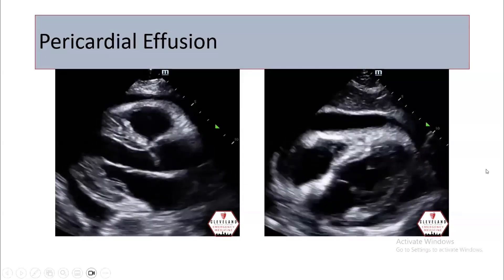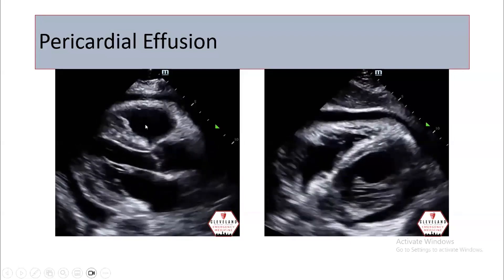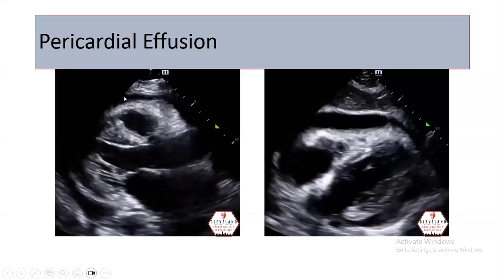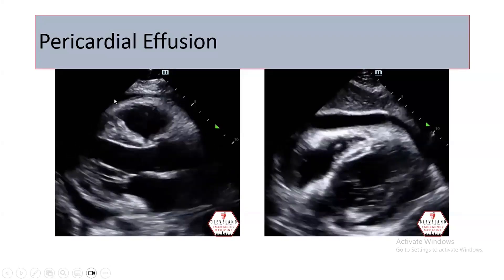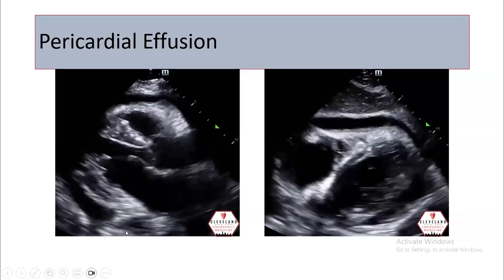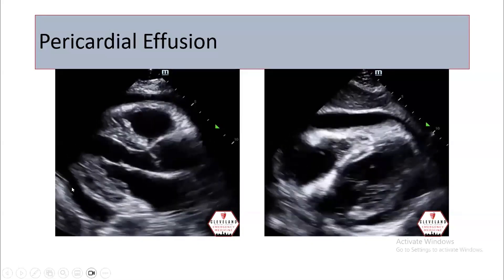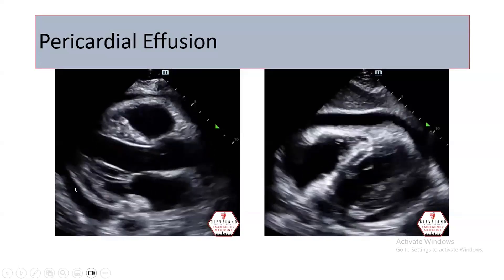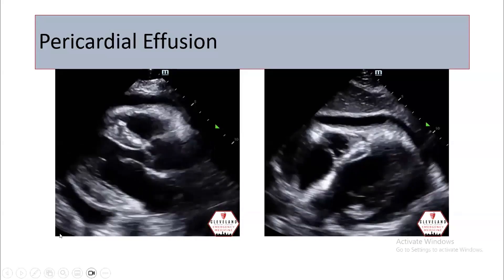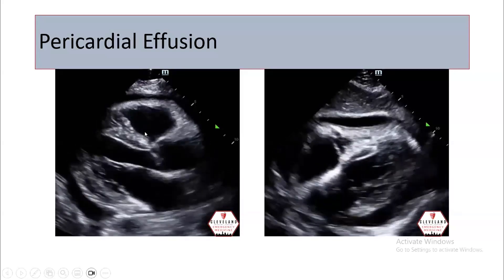So if we talk about the pericardial effusion, this is how it looks from the parasternal long axis. There is anterior pericardial effusion and posterior pericardial effusion. And this is the descending aorta — the descending aorta is here. So if it's the descending aorta and the pericardial effusion is here, and the effusion is here below the descending aorta, this is a pleural effusion. But anyway, this is pericardial effusion, not tamponade.